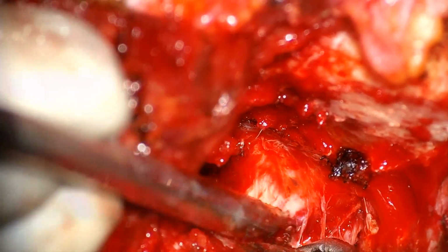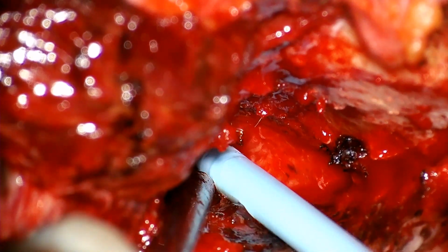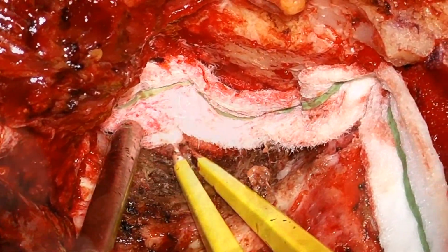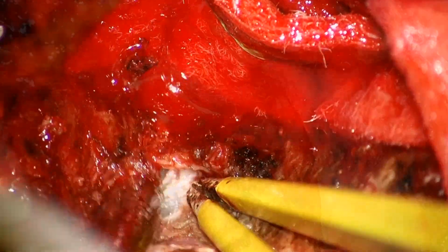By doing this, we have access to the anteromedial surface of the meningioma, and it can now be devascularized. We achieve hemostasis of this space with direct injection of FloSeal and gentle compression with a patty. Now, the dura overlying the tumor is coagulated with bipolar for devascularization, and prior to opening the dura, we attain some tumor debulking and send a specimen for frozen analysis.